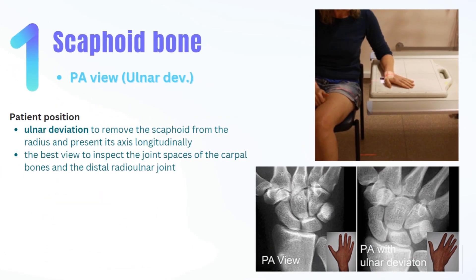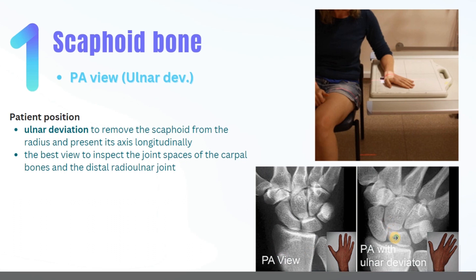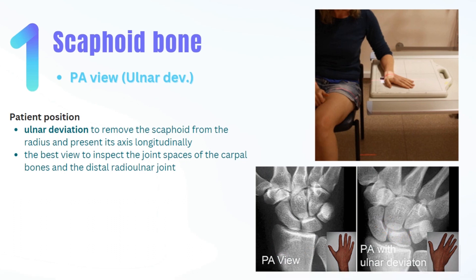The first projection is the PA with the hand flexed toward the ulna bone. This ulnar deviation removes the scaphoid from the radius and presents its longest axis. Looking at these two X-rays from the same patient — this is a PA view and this is a PA with ulnar deviation — you can see how clearly the fracture is visible here. In the PA view you can see it, but the ulnar deviation view is the best to illustrate the scaphoid fracture and also to inspect the joint space of the carpal bones and the distal radio-ulnar joint.